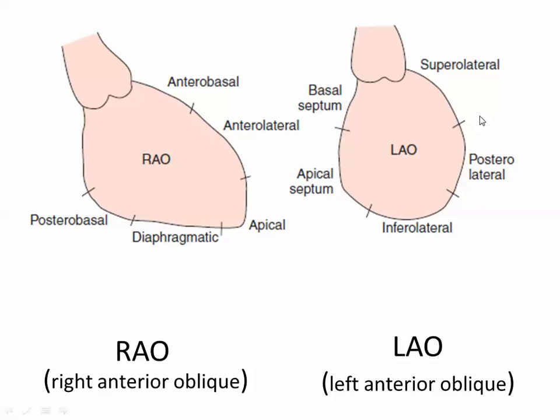So, what is this view? Is it the LAO? How do we know that it is the LAO? Where do you expect the spine will be? Here or here? Here. Yes. Okay, and the direction of the ribs will be here. Okay? My left hand.